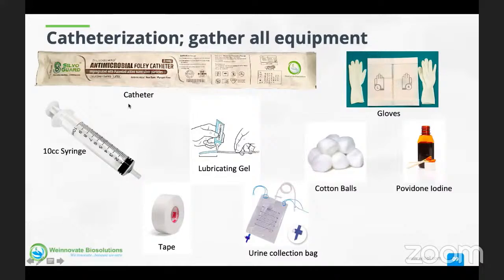For that, the things you are going to require are an antimicrobial catheter, a 10 cc syringe, sterile water, cotton balls with iodine, lubricant, sterile gloves, proper lighting in the place, urine collection bag, a Velcro strap and anchoring tape, and a disposal bag. Once you arrange all these things in a tray, a few companies also offer a tray kind of solution in which all the other things are available along with the catheter. Right now, using an antimicrobial catheter will reduce the chances of infection to a much larger extent.